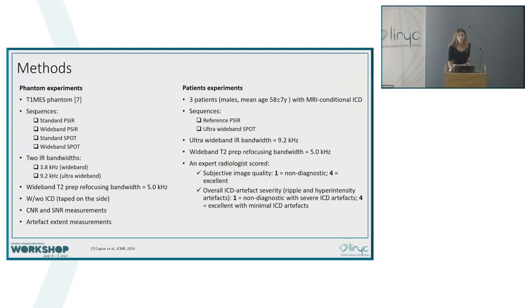We then applied this technique in 3 patients. Actually, I changed a bit the slide, and I will show you 4 patients with MRI conditional ICD. So the measurements were performed here at the CHU of Bordeaux.